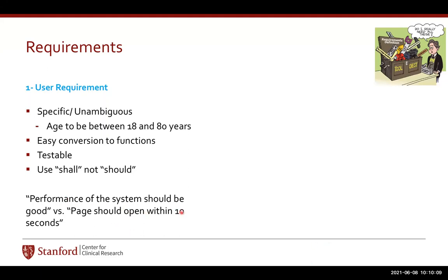Page should open within, performance of the system should be good. What does it mean? Can you test good? You cannot. Good for you is something else than good for me. So, you can really write it like that: the web page should open within 10 seconds. I think I can test that.